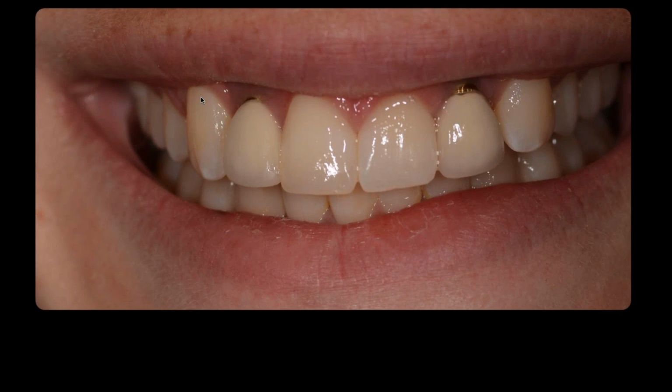Now, look at this patient. I want to show you a patient where the imaging makes a major difference. So this woman comes in and she smiles and she says, see? And I went, I see. She had implants placed for the laterals, 7 and 10, by somebody 10 years ago who just put them in. And then she had the abutments made and the crowns.